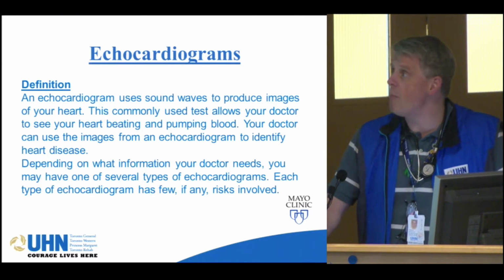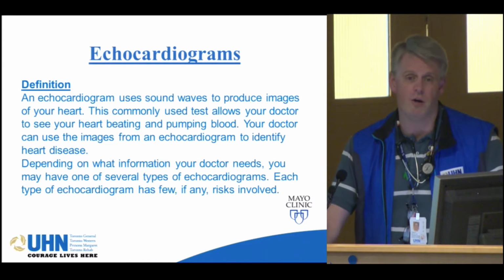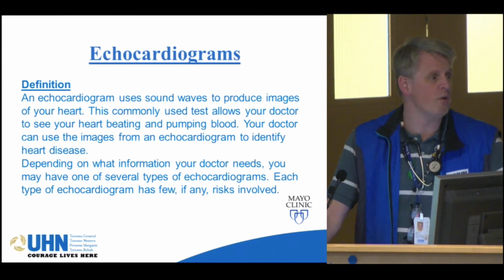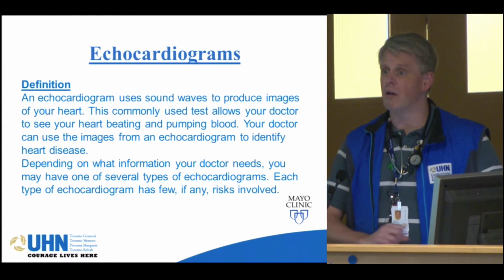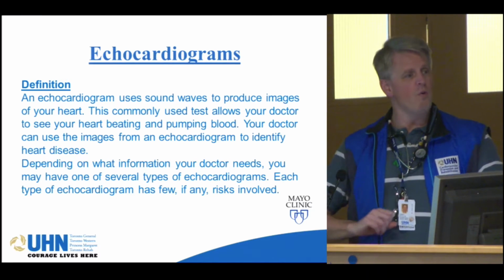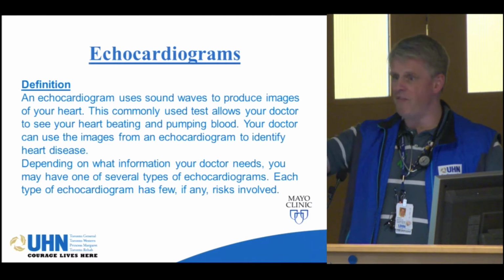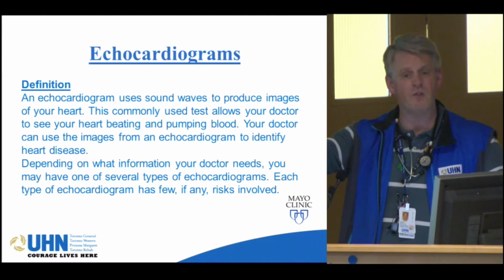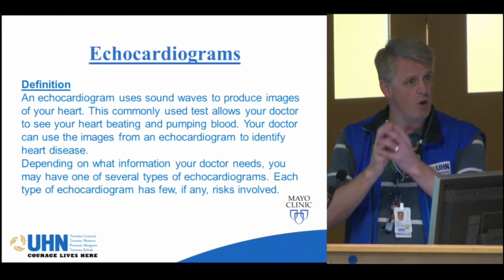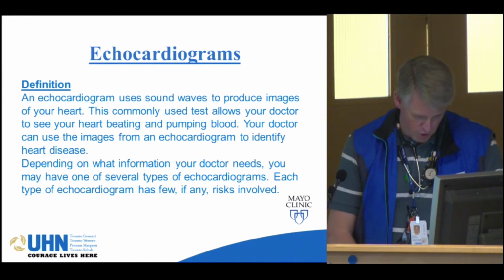And probably the most common way that your cardiologist will do that is via something that's called an echocardiogram. All right, so what is an echocardiogram? Many people are familiar with echocardiograms because that's what we use on pregnant women. All right, you get that little wand, you put a little bit of gel on there, and you put it over the tummy, and what it does is it generates sound waves. Those sound waves come off of that wand, or transducer is the official word for it, bounce off the various structures, come back to the transducer where they're received, and you get this nice picture. Right? That's generally how an echocardiogram works.